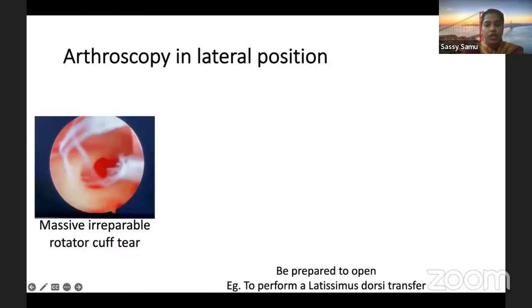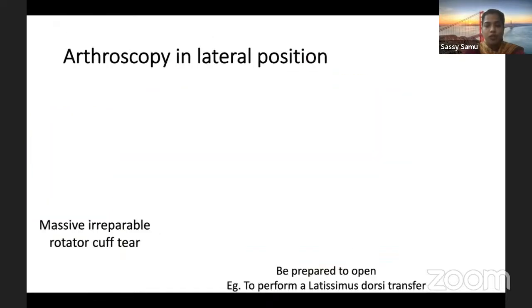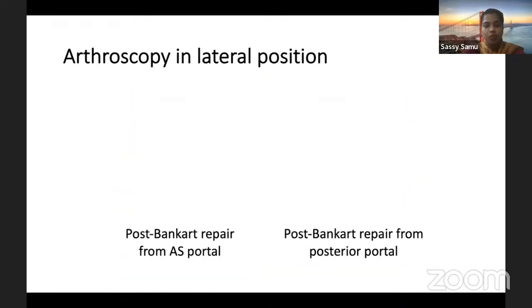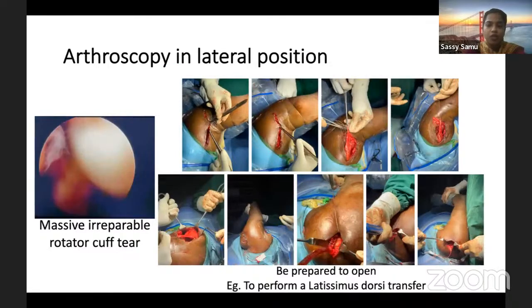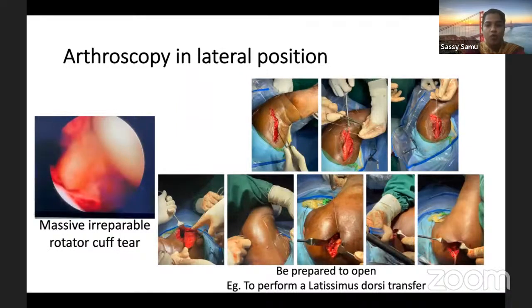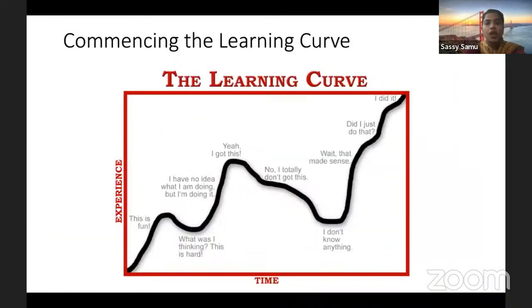Get yourselves trained to do an open procedure. As a novice surgeon, you should also understand how to perform open repair. For example, a mini open rotator cuff repair or tendon transfer procedures, which may be needed in case you are not able to do it all arthroscopically. Understand the learning curve. The curve is not as steep as you think. It has its own ups and downs.